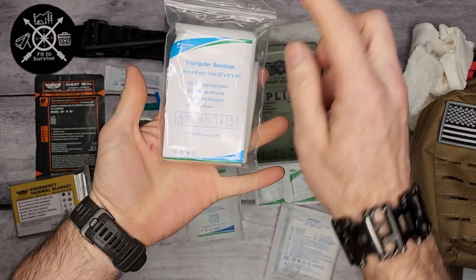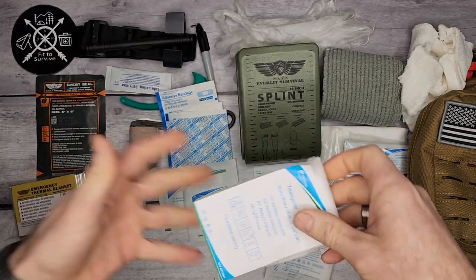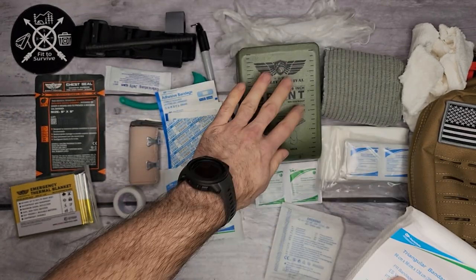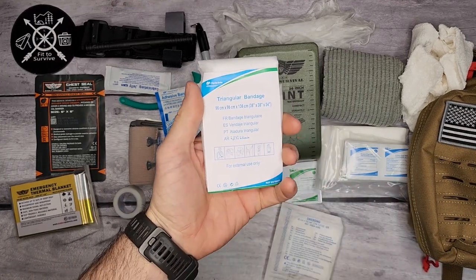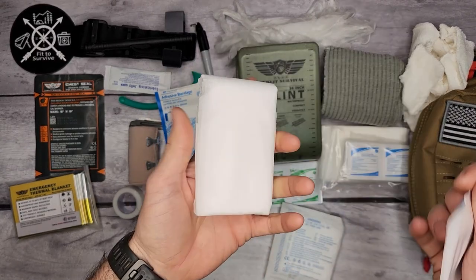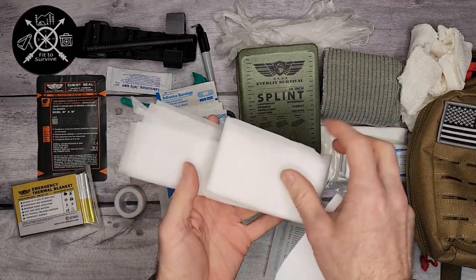There's also a triangular bandage, and I like that they have some explanations of how it can be used. These are often used for slings — if somebody broke their arm, you've splinted it but want to have it elevated above their heart, you can use this. Or you can use it to wrap around the head, arm, or wherever else — it's basically a really large bandage.